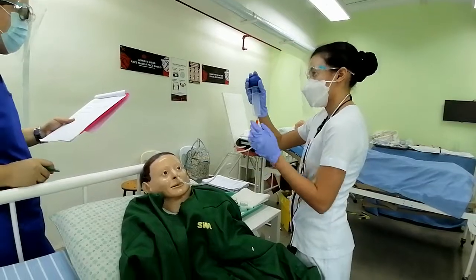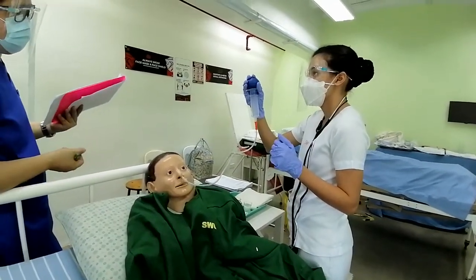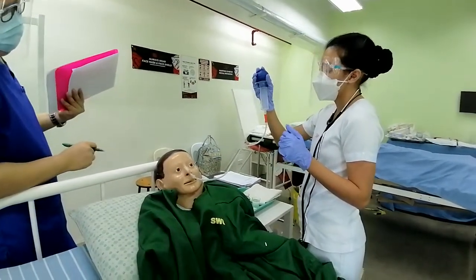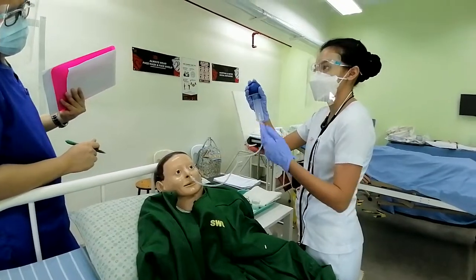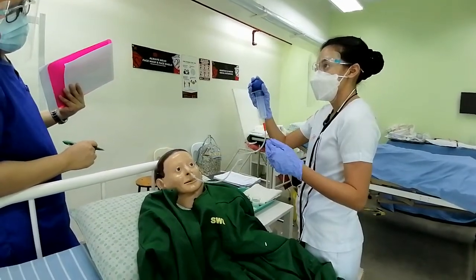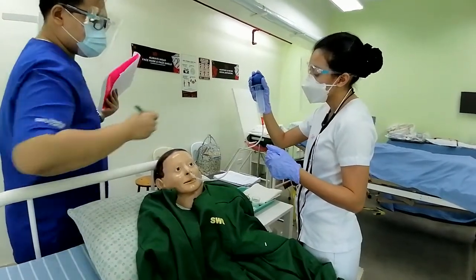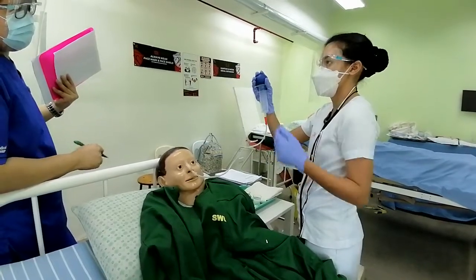After that, say for example, you have 30 cc of aspirated residual volume. Say for example, you fill this part, what are you going to do? First, sir, I will check the chart for how much is to be administered. So, say for example, you aspirated, what's next? I will report it to the physician, sir.